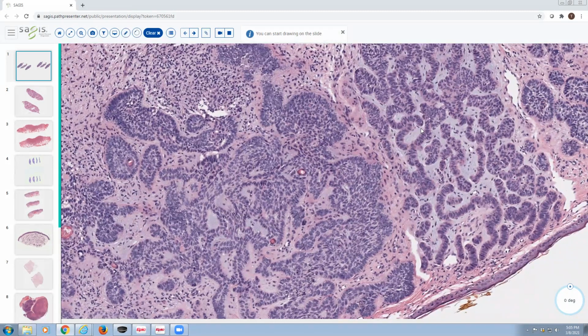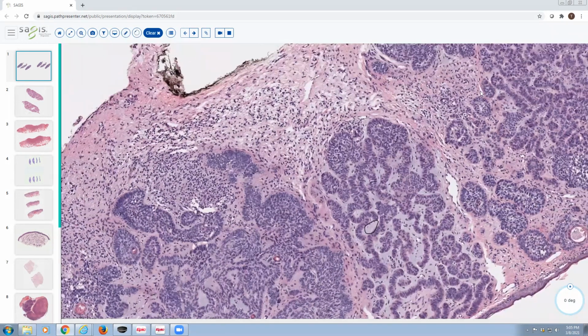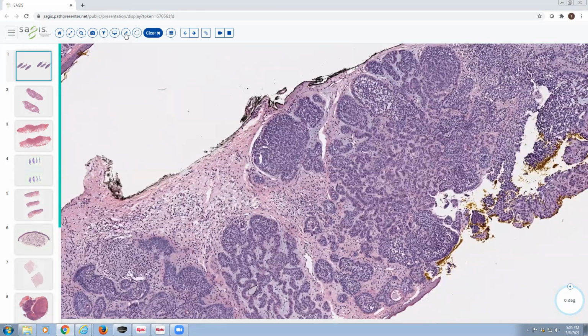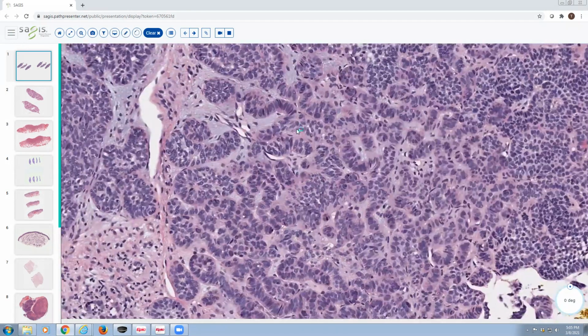And mucin, remember, has a bluish gray color. So you've got this blue-gray stroma between the tumor strands. And then when the tumor strands or nodules are mostly small, so we're talking about clusters of 5 to 10 cells, this is called a micronodular basal cell carcinoma.